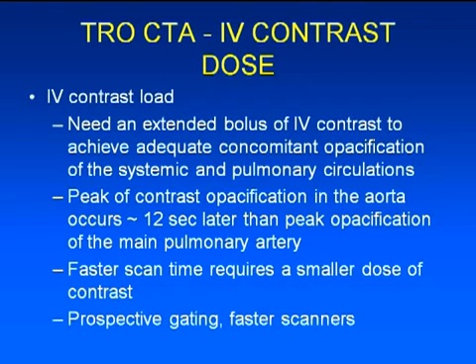So if you have a patient who is older but has an impaired renal function, so you're more concerned about the kidneys rather than the radiation so much, you can decide to do a prospective gating rather than retrospective gating and give less IV contrast in that case. So you have to tailor for each patient.